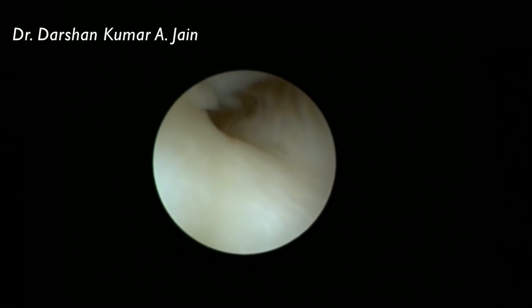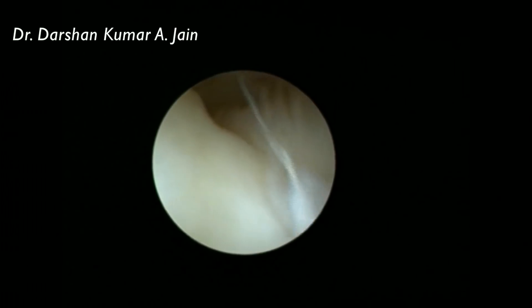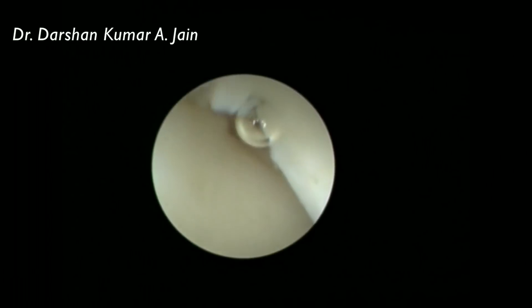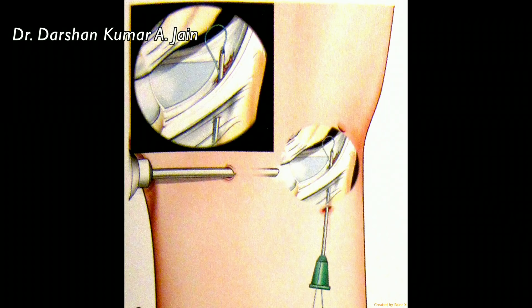As mentioned, there are two tears. One is the peripheral capsular tear, which we can see here. But we also need to rule out the foveal insertion tear, which is demonstrated by a hook test — by going underneath the TFCC and trying to lift off. There is no lift-off here, meaning the foveal insertion is intact. So now we proceed to our repair as shown here.